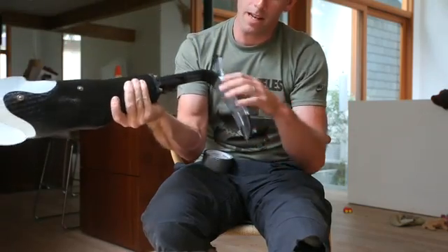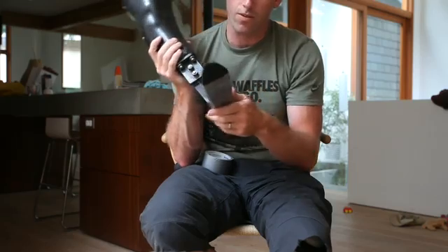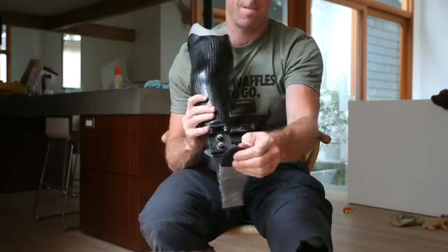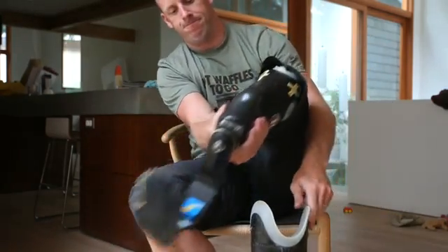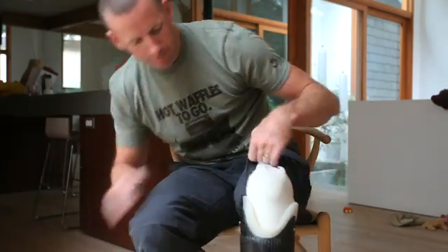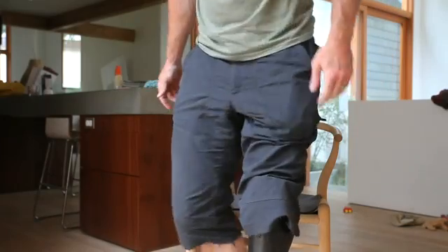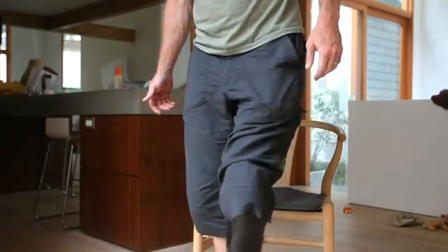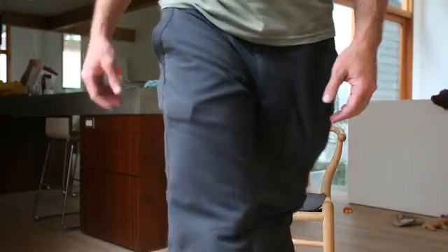Bear in mind I'm not a certified prosthetist, nor is this exactly what you'd want your foot to look like, and it still is broken — but I am able to walk on this thing. It's a little bit noisy, but we're in business.